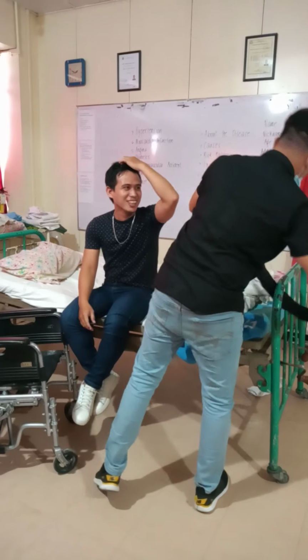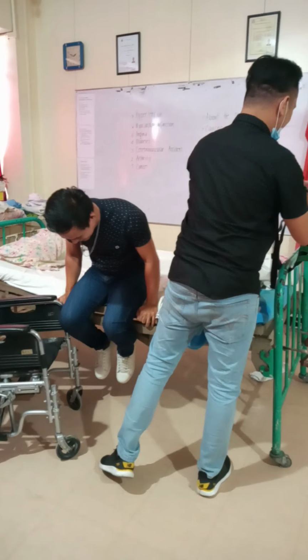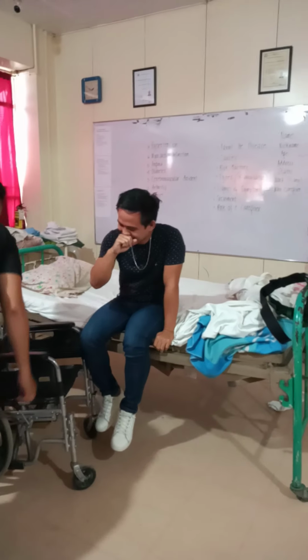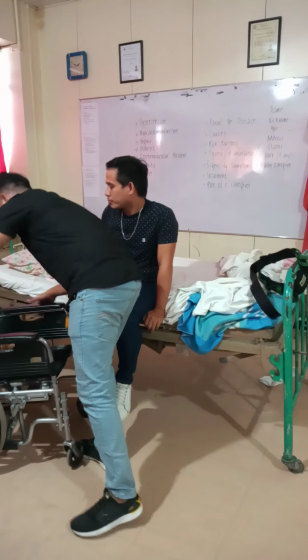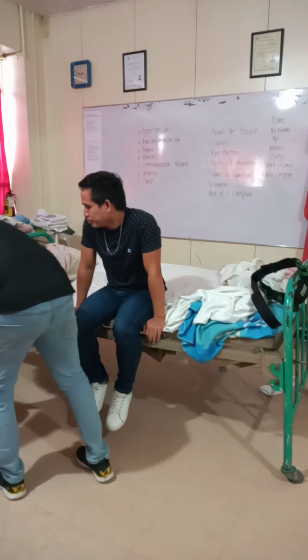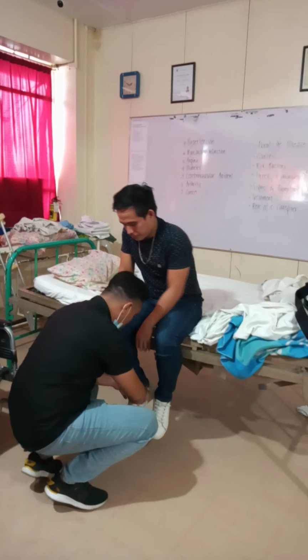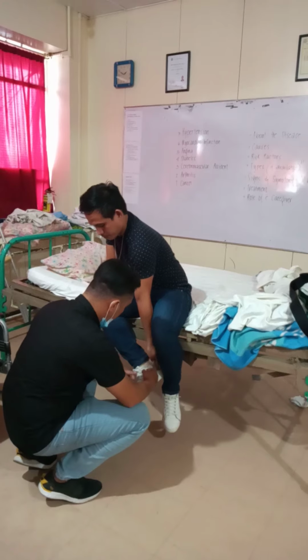While the patient is facing away, move the wheelchair away, okay? Then remove the footwear of the patient.